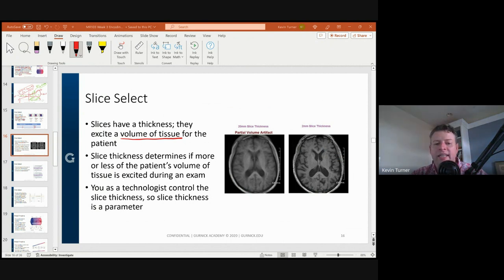And it depends a lot of times, like our slice thickness is usually dependent on the body part. If I want to scan a pituitary, which is a tiny little gland in the middle of your head, it's really small. I need some thin slices. If I want to scan my humerus, the thing's freaking huge. Oh, I mean, the humerus itself is huge, right? Which means you can afford to use big slices. So it's usually the size of the pathology we're looking for.